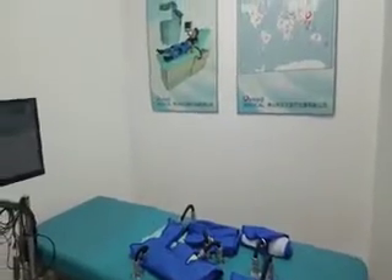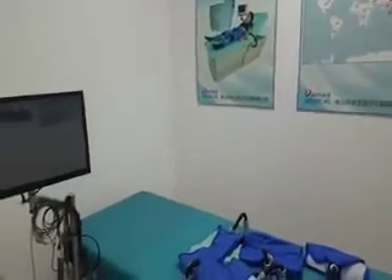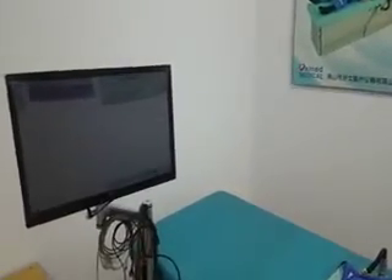Welcome to the Vamed Medical ECP MC3 product. Through this video, you will learn how to use ECP MC3 equipment safely and effectively.